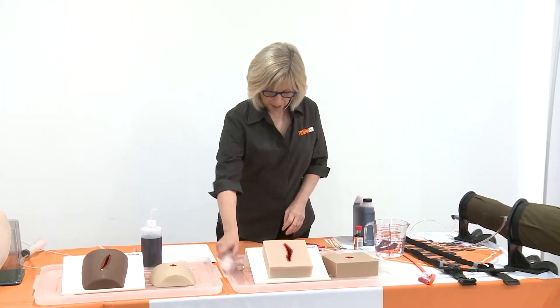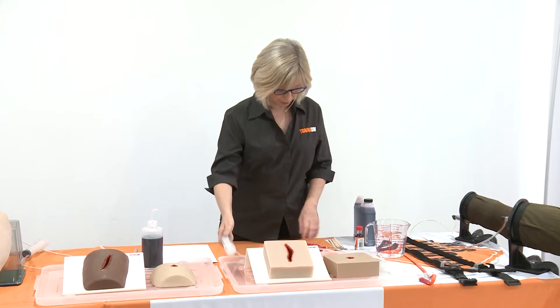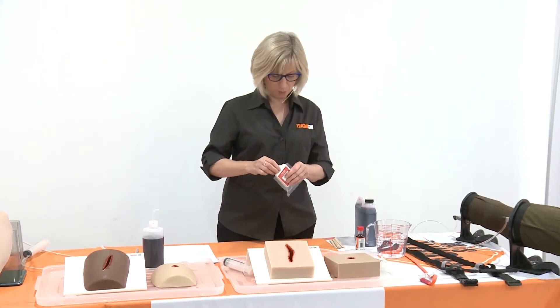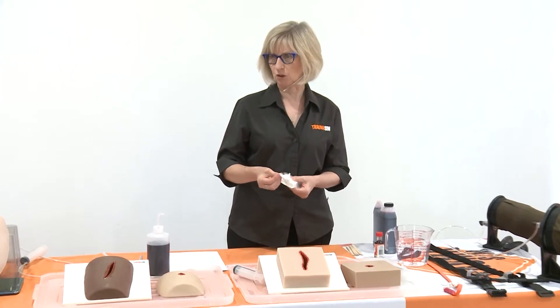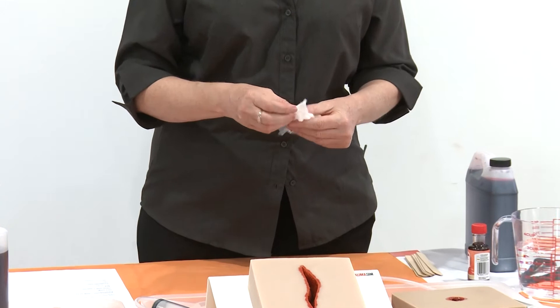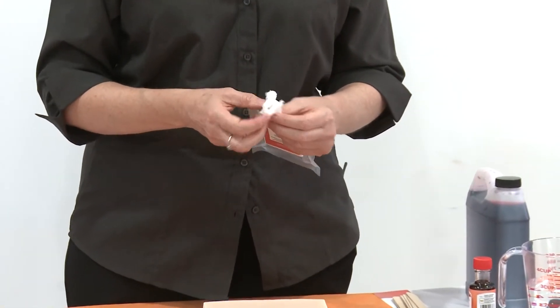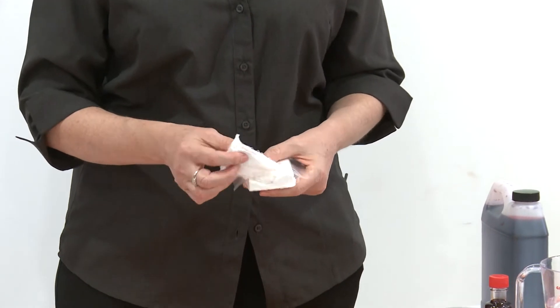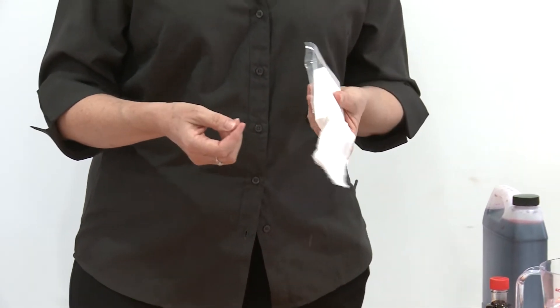We've got syringes that come with it, we've got some gauze, and what we have here is just a compressed gauze for training. The actual hemostatic agent itself is very expensive, so for training that's really not something that people want to use, whereas the cheap gauze is an alternative.